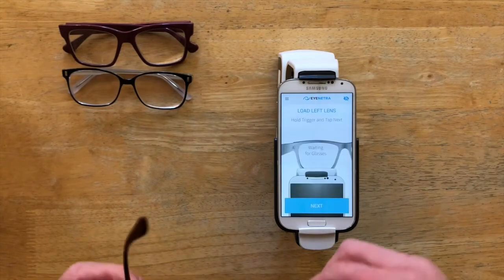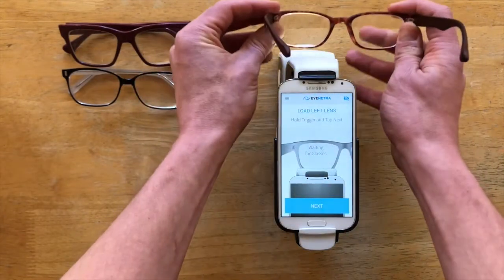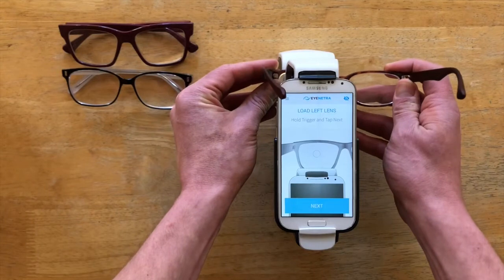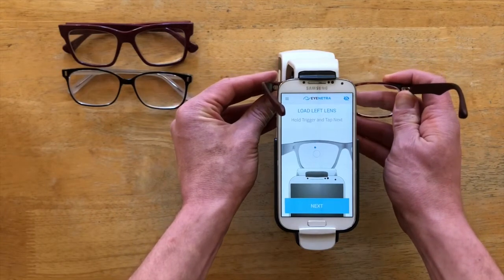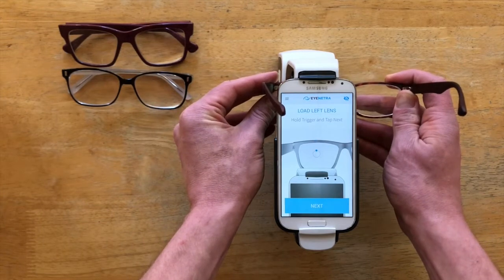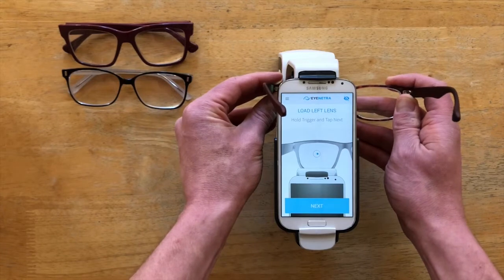And then I'll grab my single vision glasses, and I'll start left lens first, temples up, and I'm going to bring the glasses into the mouth of the Netrometer. And what you'll notice on the screen is that you'll see a small dot appear, there it is, and that dot will track along with the glasses movement as I move them. So all I need to do is just align that dot anywhere within that circle, it doesn't need to be dead center, but the closer the better.